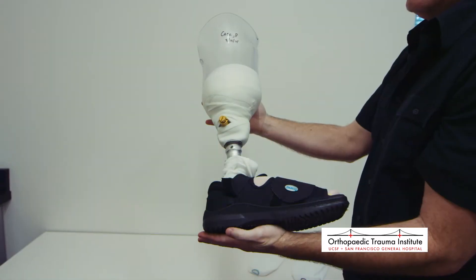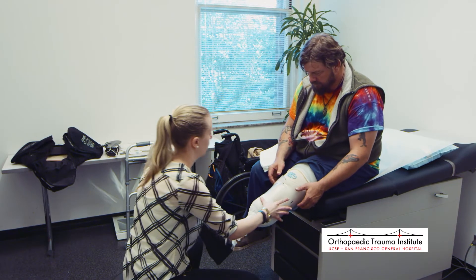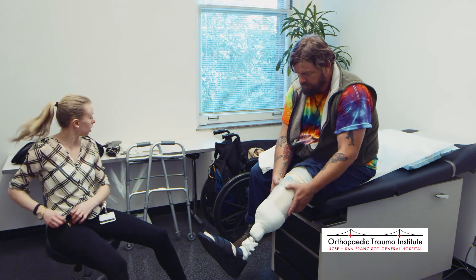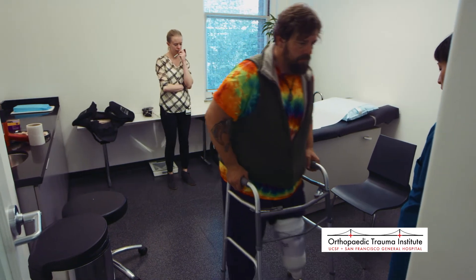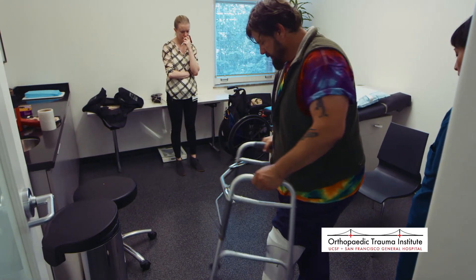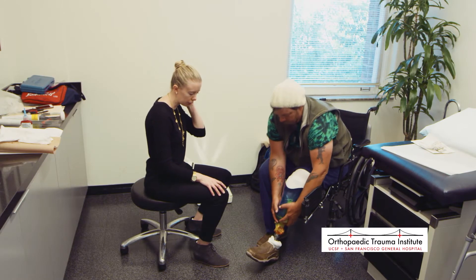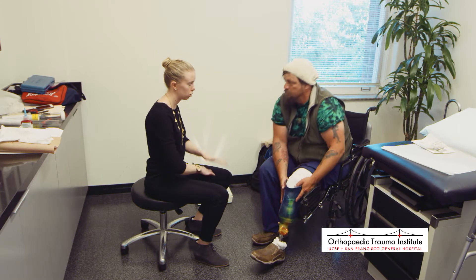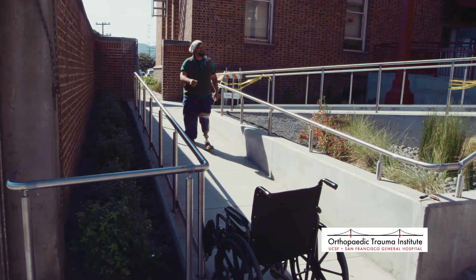Once we have a comfortable fitting with just the socket, we'll attach whatever is needed underneath — whether that's a knee for an above-knee amputee or just a foot. The socket is the attachment point for all those things. We'll attach these in the initial socket fitting, have the patient walk, make sure it's comfortable, and sometimes send them home on it. Once the whole system is comfortable and stable, we'll move to a final socket made out of fiberglass or carbon — more durable and longer lasting.